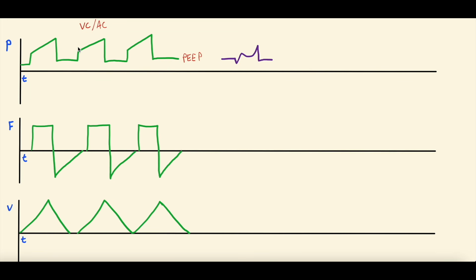Compare that to here where you have this smooth line, and then think about it conceptually. What is this negative dip? Well, this is a pressure scalar, right? So anything that's going down means the pressure is going down. And when someone is initiating a breath, they're sucking in, right? Breathing in, their diaphragms contract and they have negative intrathoracic pressure. That's how their lungs inflate.